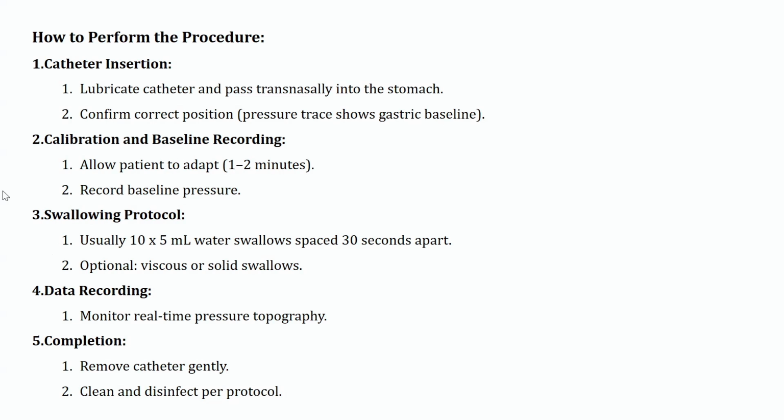After we insert the catheters, we have to wait for 1 or 2 minutes for the patient to be comfortable, to adapt to his position and to the catheter in his nose and mouth. Then we have to record the baseline pressure. Then we can start the protocol.